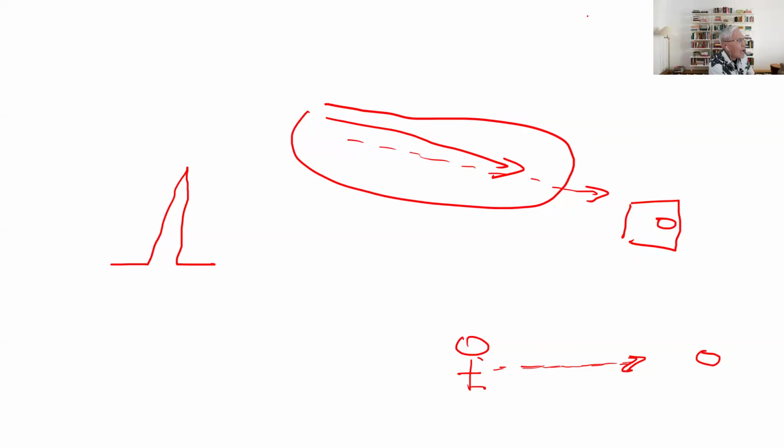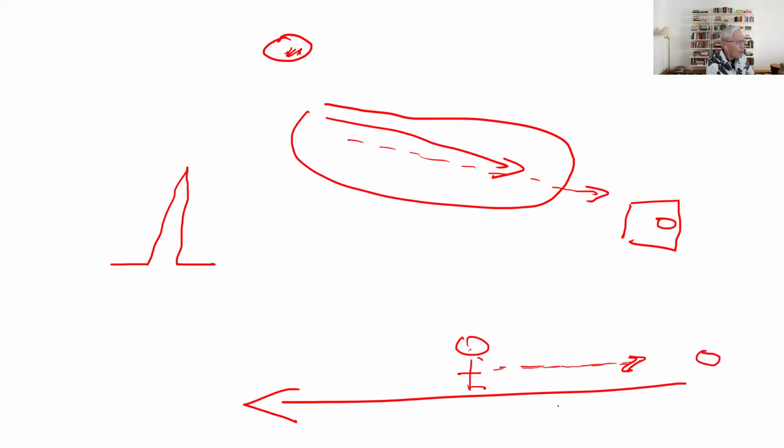But sometimes the camera might be positioned over here. So if it's positioned over here, it's similar to your friend. You're taking a picture, but your friend is going away from the camera. What happens to the image of your friend? Does it become bigger or smaller? Smaller. So similarly, in an electrocardiogram, if we're viewing it from this area, then it's going to be like this.